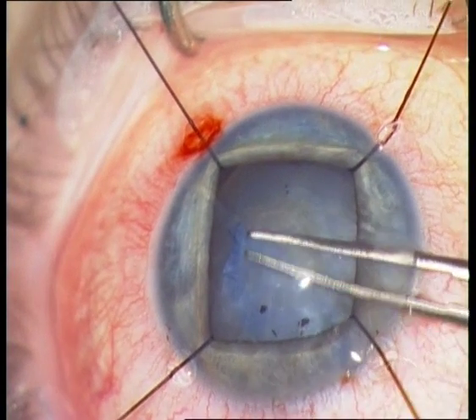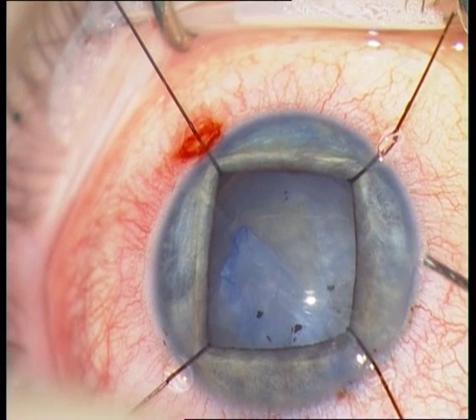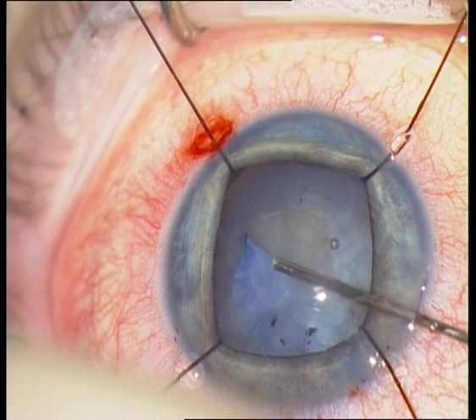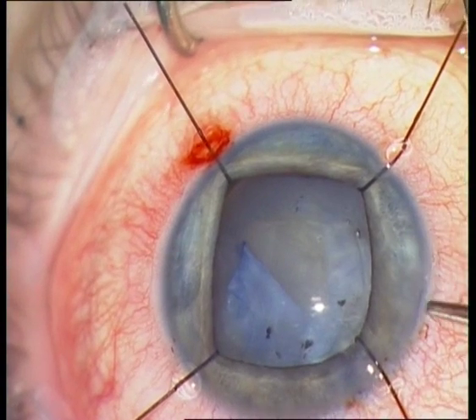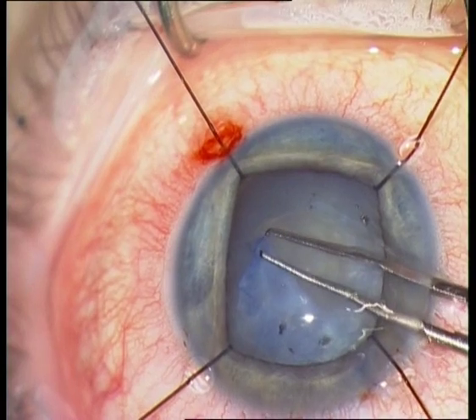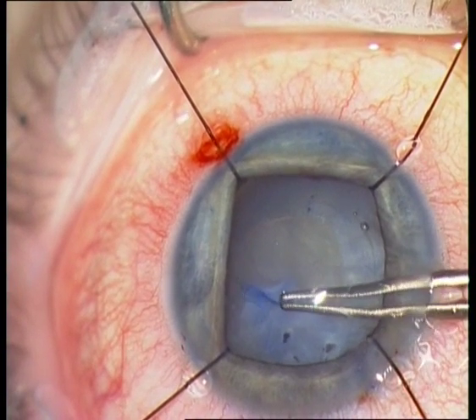You can see that this very thick membrane really needs intravitreal scissors. These are scissors for intravitreal surgery, but there are also several scissors available for the anterior segment which you can use through a paracentesis.